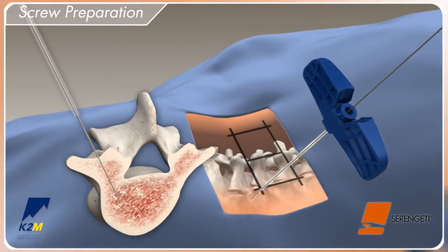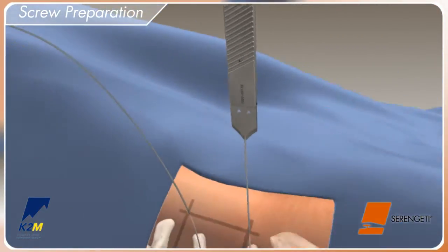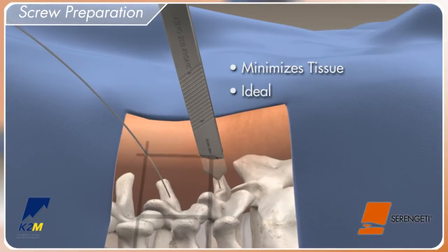Next, carefully remove the needle and verify that the placement of the guide wire has not been compromised. Position the cannulated perfect scalpel over the guide wire and advance through the fascia to create a consistent fascial incision.